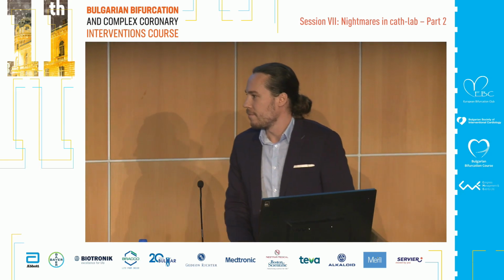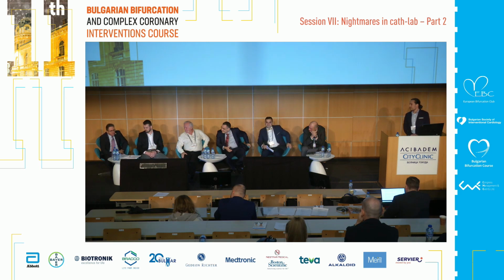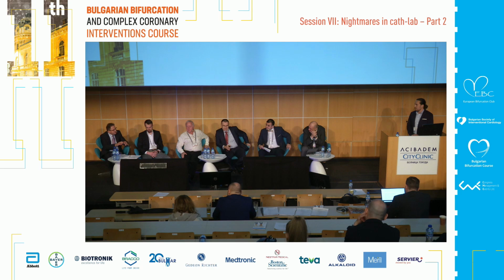Congratulations for a great idea for closure. This is something new. I love it, but for me, I have some doubts about the consequences in the follow-up because of this permanent pressure on the vessel. What about the, let's say, continuity of the vessel wall?